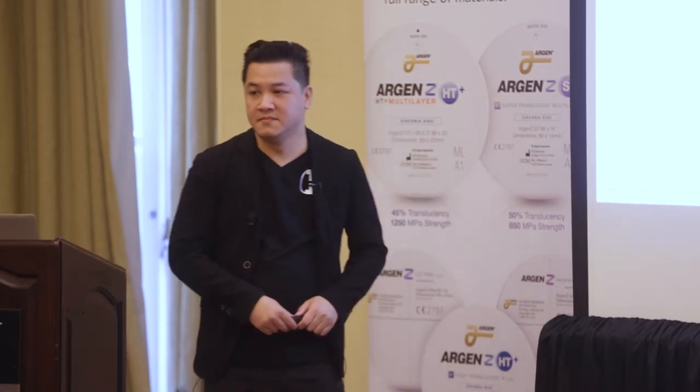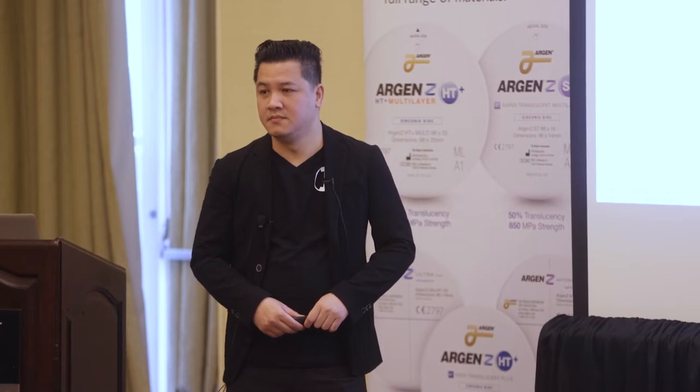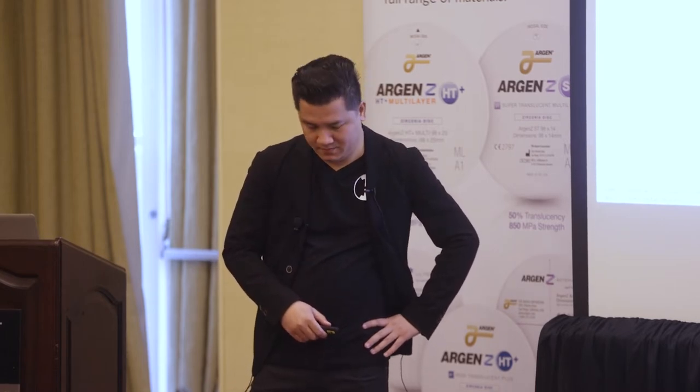Because I know my workflow is a little unique, so I know I can send that out prior to sending the case out, because with certain cases, when they do go awry, I will send a design and tell them, make the modifications on the crown, send me a picture, I'll make the modifications here, and send them a picture to get approval. Yep. But are you doing that on a case-by-case basis is my question.